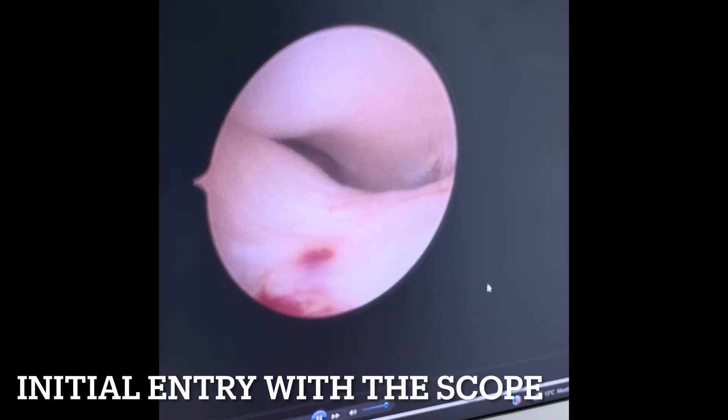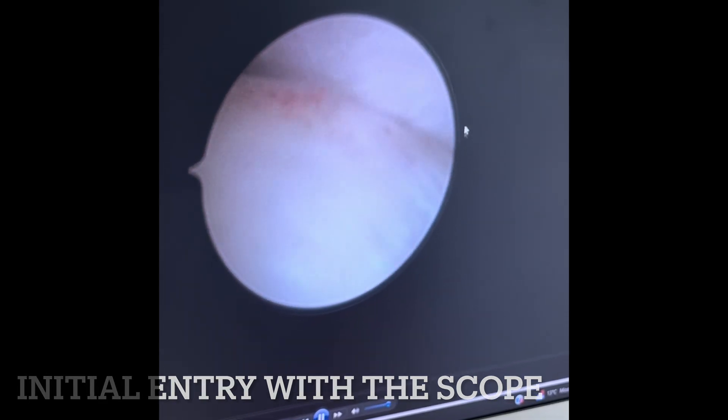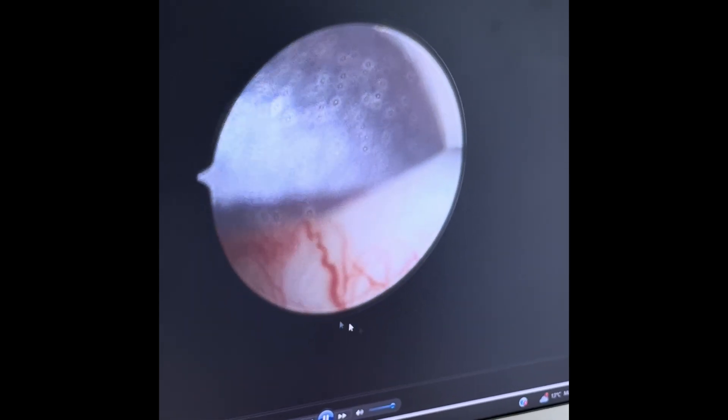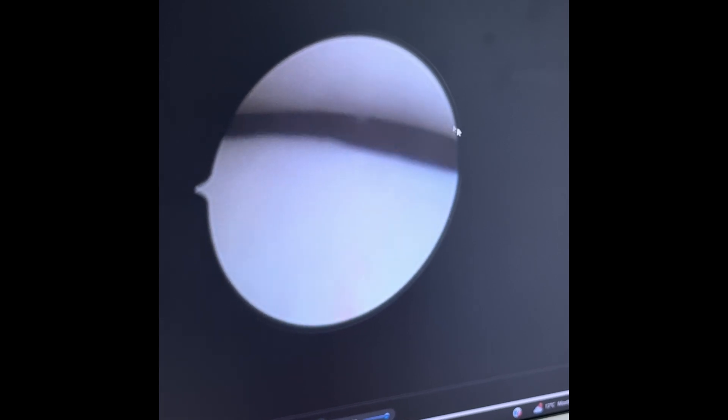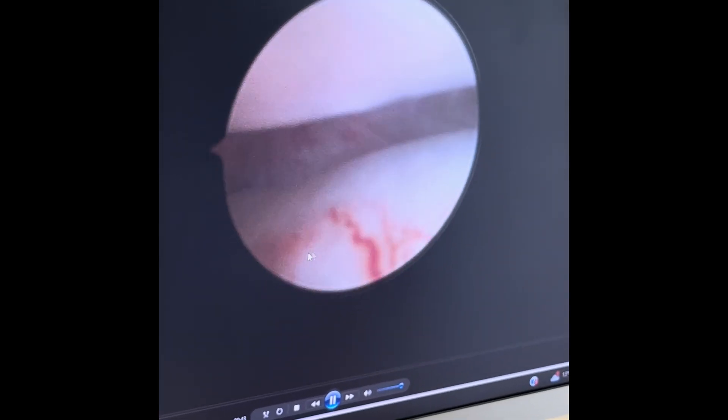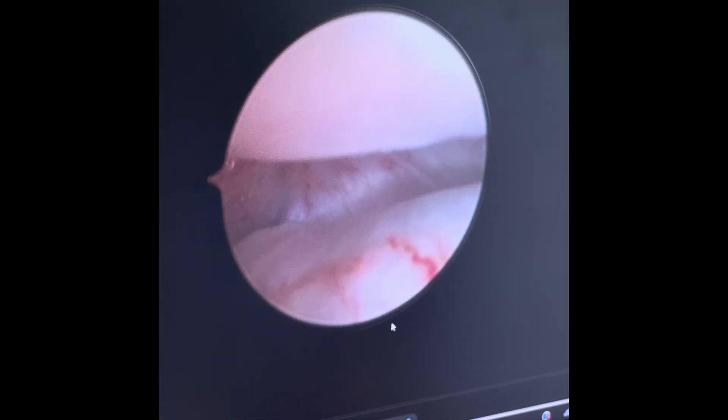This is the view on initial entry into the left temporomandibular joint. At this stage there's just the outflow needle and the scope. The scope is at the very posterior part of the joint so we're looking forward — this arrow here demonstrates how we're looking forward into the anterior recess and medial compartment. We're looking to see if there are adhesions, where the disc is displaced, if there are perforations, and to assess the general state of the joint. In this case you can see the disc is anteriorly displaced, and this is the appearance of blood vessels in the synovium which have crept up.